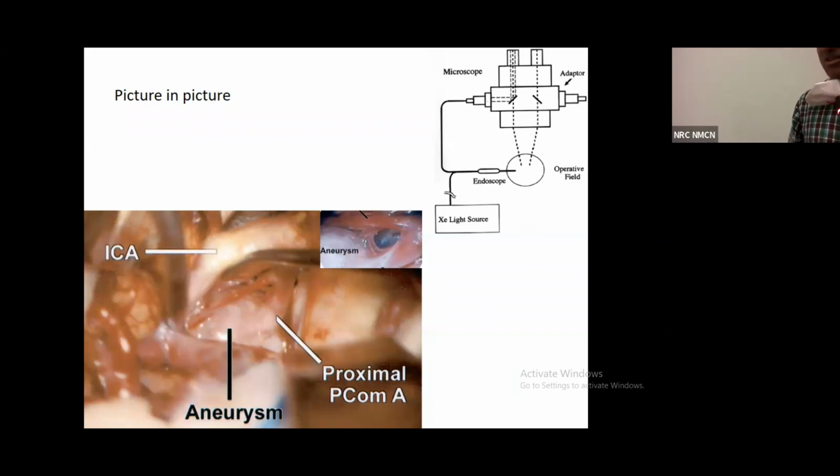Yes, ma'am. Robotic surgery is being done in neurosurgery also, but only for very specific indications. It is used for urology, and for endocrine surgery it is pretty good, but for neurosurgery it is still in its infancy. It is still being developed. It is used for some specific things, like taking a biopsy, or for what we know as DBS, deep brain stimulation. Those parts can be done with robotic surgeries, but it has not become very active in neurosurgery as of now.